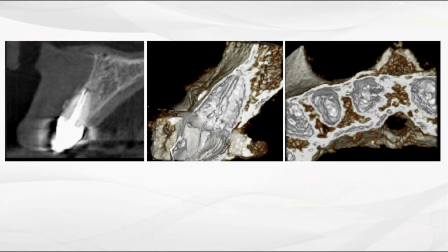If you look at the CBCT at the time of visiting our dental clinic, the fractured labial wall of the socket does not appear to be fused, and in 3D images, the fractured fragment at the occlusal surface of labial marginal bone level appears to cause chronic inflammation and pain as it continues to move. Diagnosis is non-union of socket wall fracture and non-fixated subluxation of tooth.